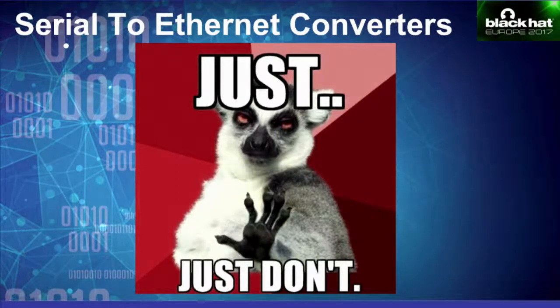Using a serial to Ethernet converter is generally a bad idea, because those small hardware devices are plagued with vulnerabilities. In fact, the U.S. Department of Homeland Security created an alert against one of the most common and most popularly sold serial to Ethernet converter devices called NPort. It's developed by a Taiwanese company called Moxa. Yes, Moxa.